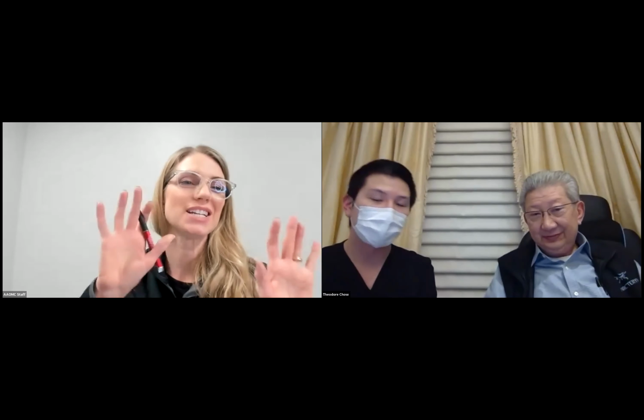I deal with two, three doctors, and most of the time it doesn't need toric. Sometimes I just doubt if the lab can really fabricate the lens in the best way. This is only my opinion, and I usually talk about how to spherize the eyeball without using a toric. That's really interesting. Two doctors who are both fitting the same design have two very different opinions on that. I think that's pretty cool.